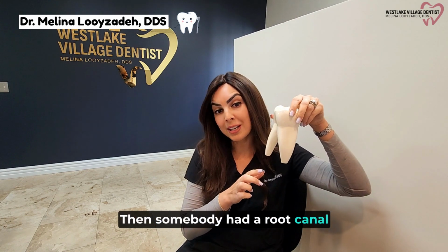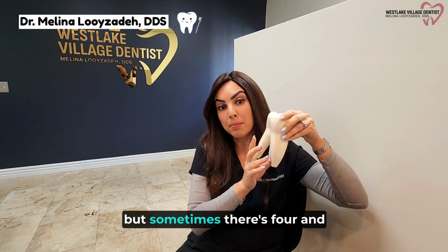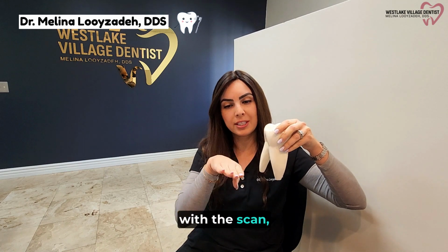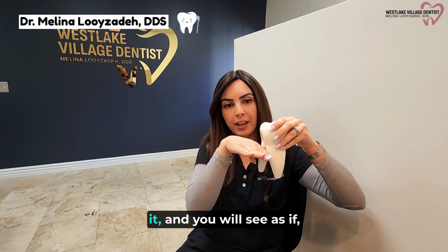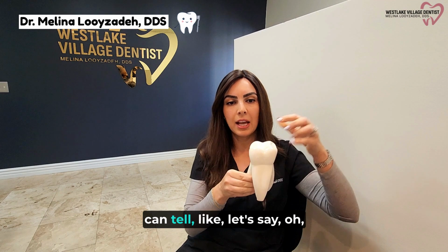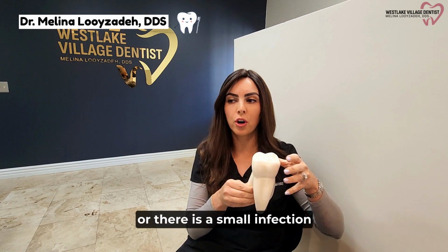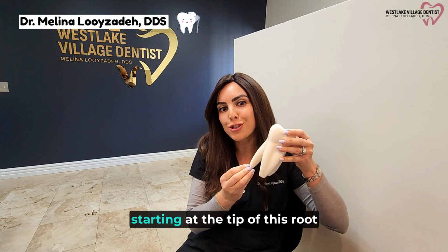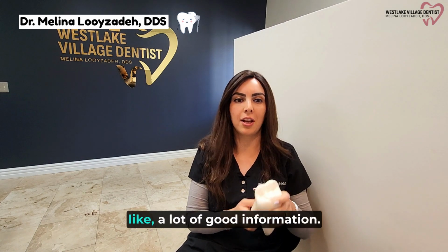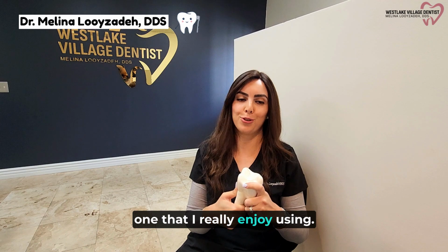Say somebody had a root canal done and there was an extra canal. Most people know there's 3, most dentists know there's 3, but sometimes there's 4 and 5, and they could get missed. What you do with the scan is you can do sections of it, and you will see as if you're cutting through here, and can tell, let's say, oh, there is a canal missing right there, or there's a fracture there that we didn't see before, or there is a small infection starting at the tip of this root that we didn't notice in a regular X-ray. So it gives us a lot of good information. It's one that I really enjoy using.